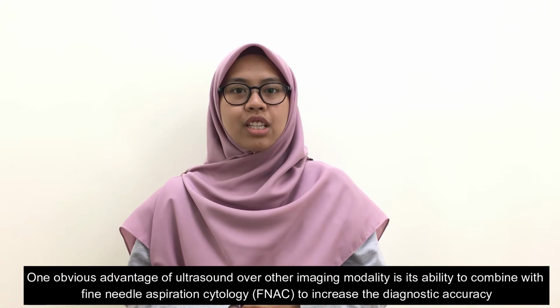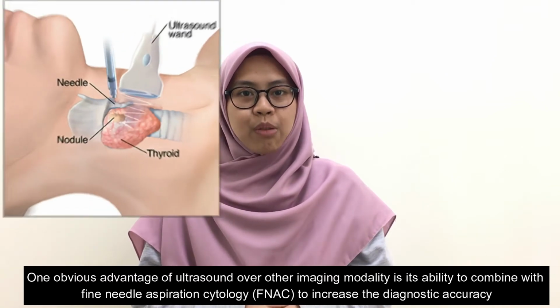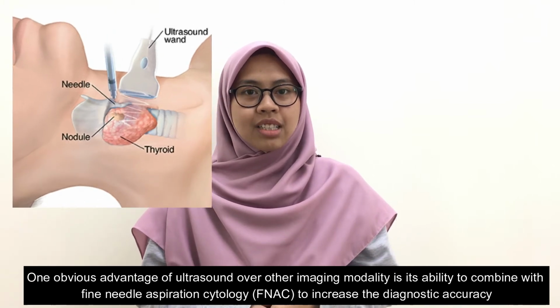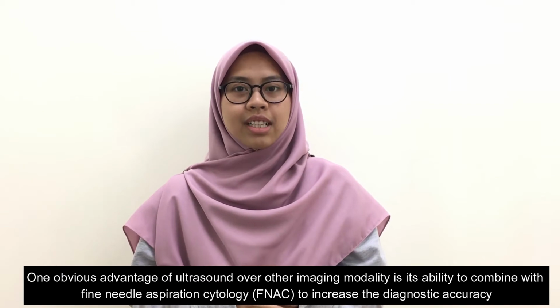One obvious advantage of ultrasound over other imaging modalities is the ability to combine with fine needle aspiration cytology (FNAC) to increase the diagnostic accuracy.